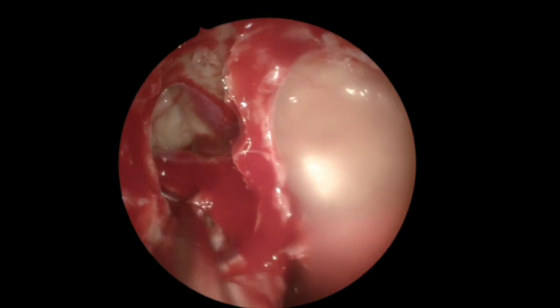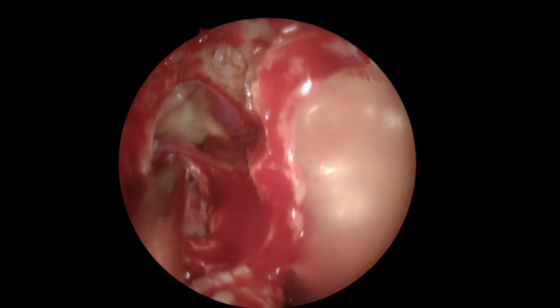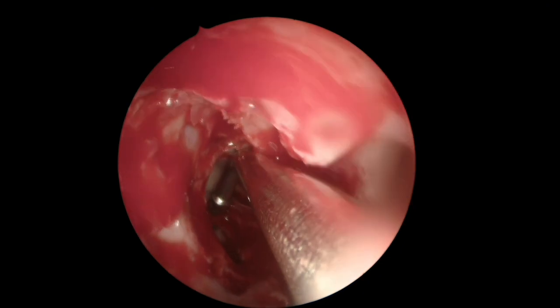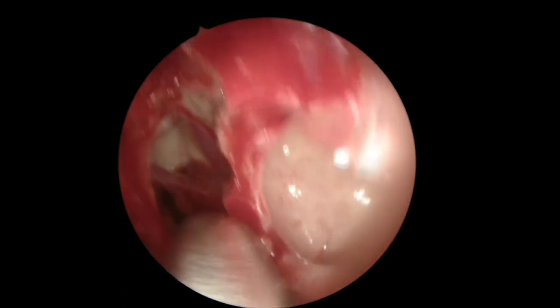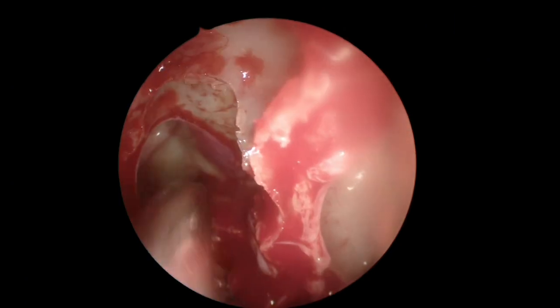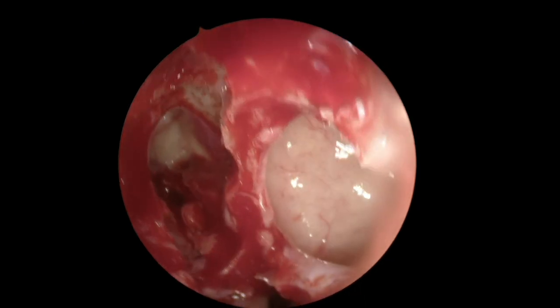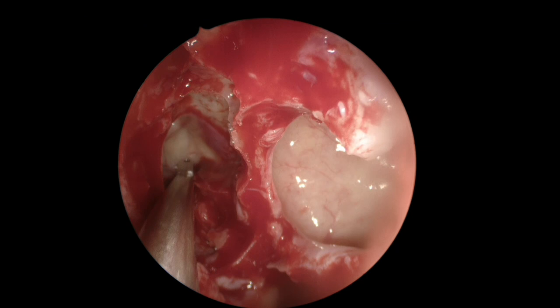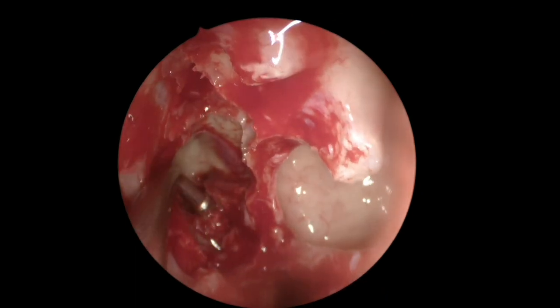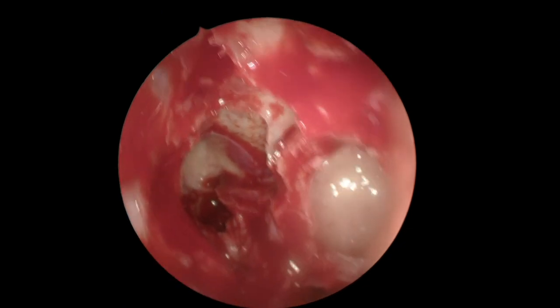If you're in the sphenoid and you go in that direction with a dissector or suction, you will not be able to progress because you'll find the clivus right there. But if you're in a posterior ethmoid cell and you go in that direction, find small resistance, and you're able to enter — then you know you're entering the sphenoid sinus. You can always confirm by entering medially to the middle turbinate to find the natural ostium of the sphenoid, but we're pretty sure we're there. We remove this bit of bone and we open the sphenoid through the posterior ethmoid.